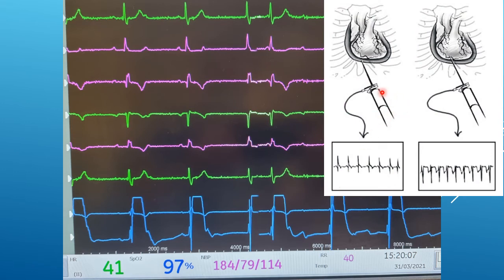Here's another example from the internet. We have our crocodile clip attached to the metal part of the needle, which then goes off to attach to the ECG amplifier — effectively Wilson's central terminal. The cardiac technician will know what that is. So our needle, if it's in the pericardium or touching the skin anywhere on the patient, will show a fairly standard ECG appearance without ST elevation. If we touch the heart, we will immediately see marked ST elevation. It's a very useful and simple way of getting extra information about where you are.